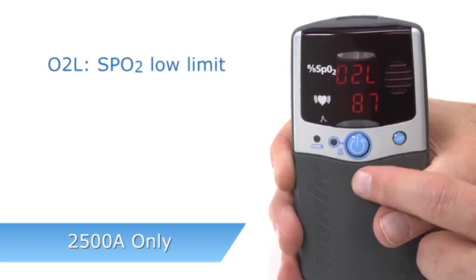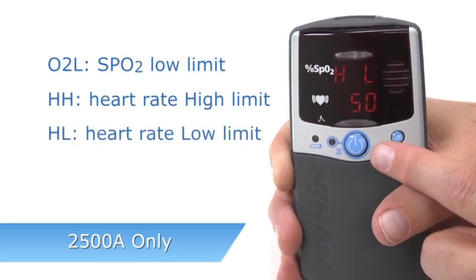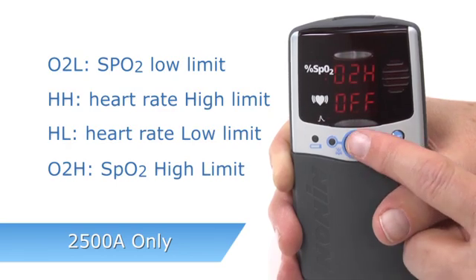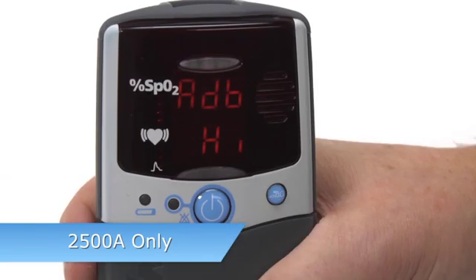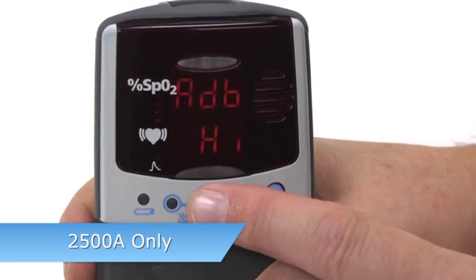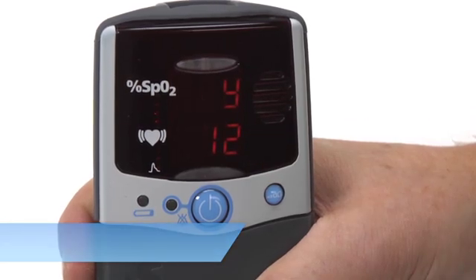If you clear custom alarm settings, you can scroll through and reset all values on the oximeter. O2L is the SpO2 low limit. HH is heart rate high. HL is heart rate low. And O2H is SpO2 high, appearing in that order. You can also see the audible alarm setting, which may be high, low, or off. You will then enter the memory, date, and clock settings just like the 2500 model.